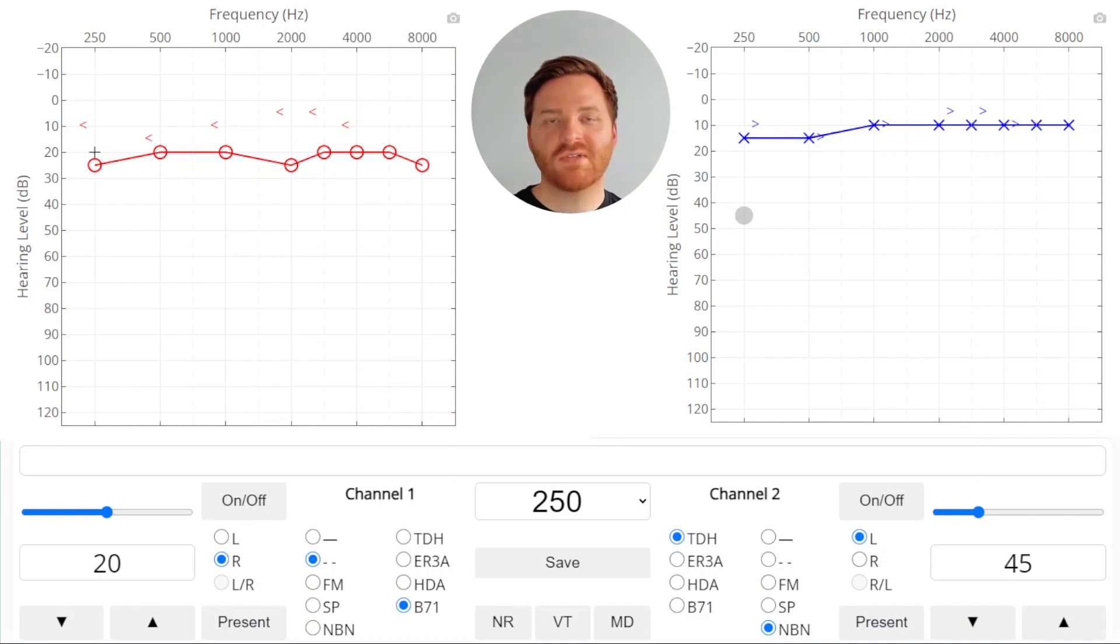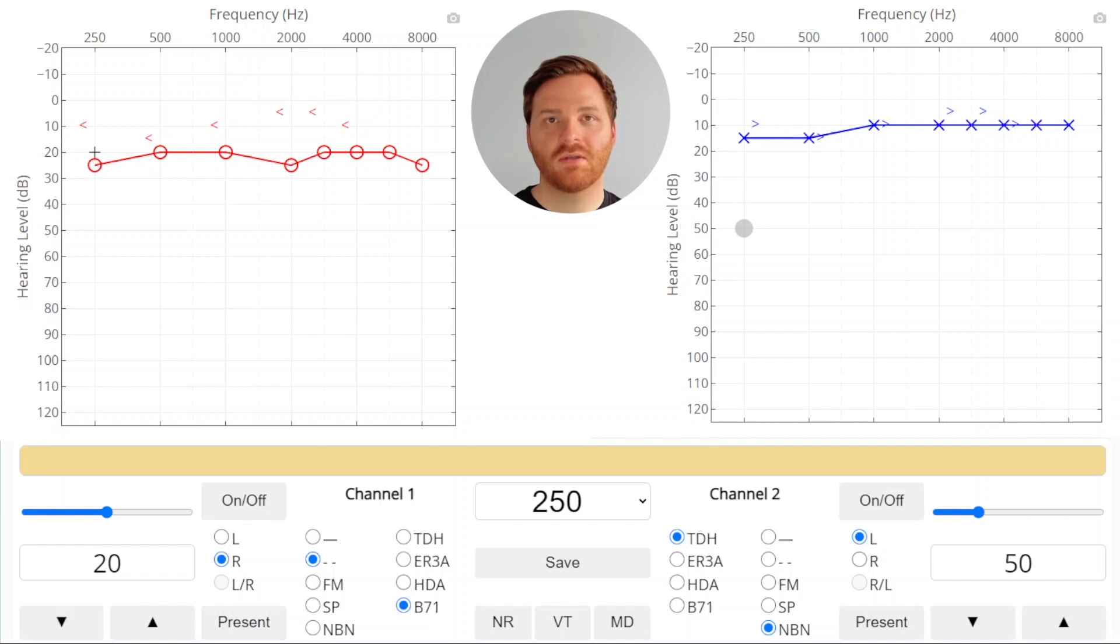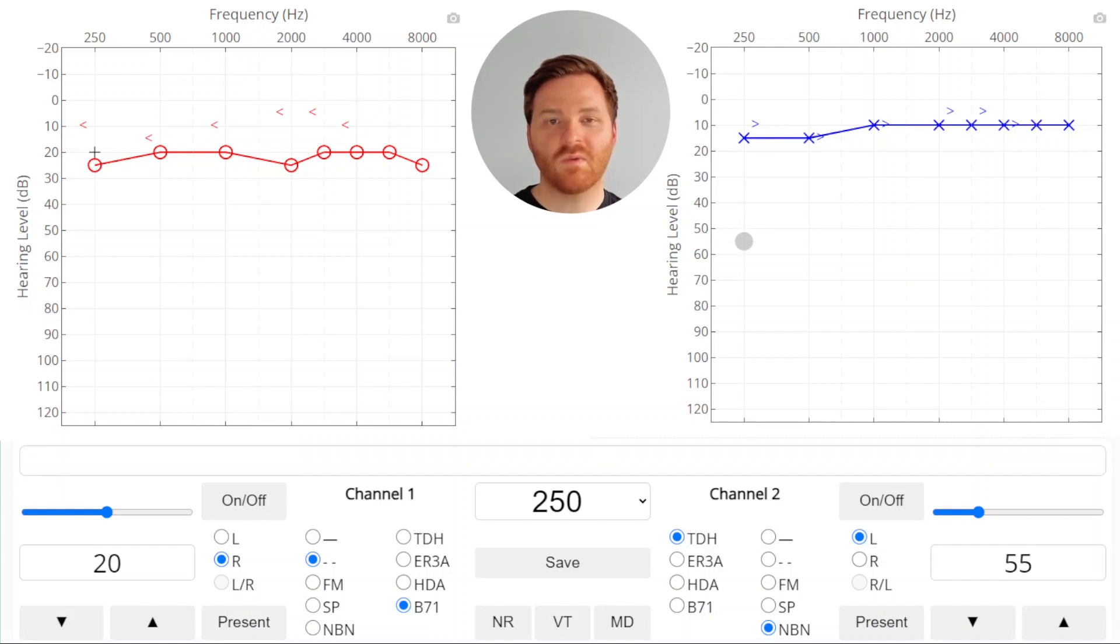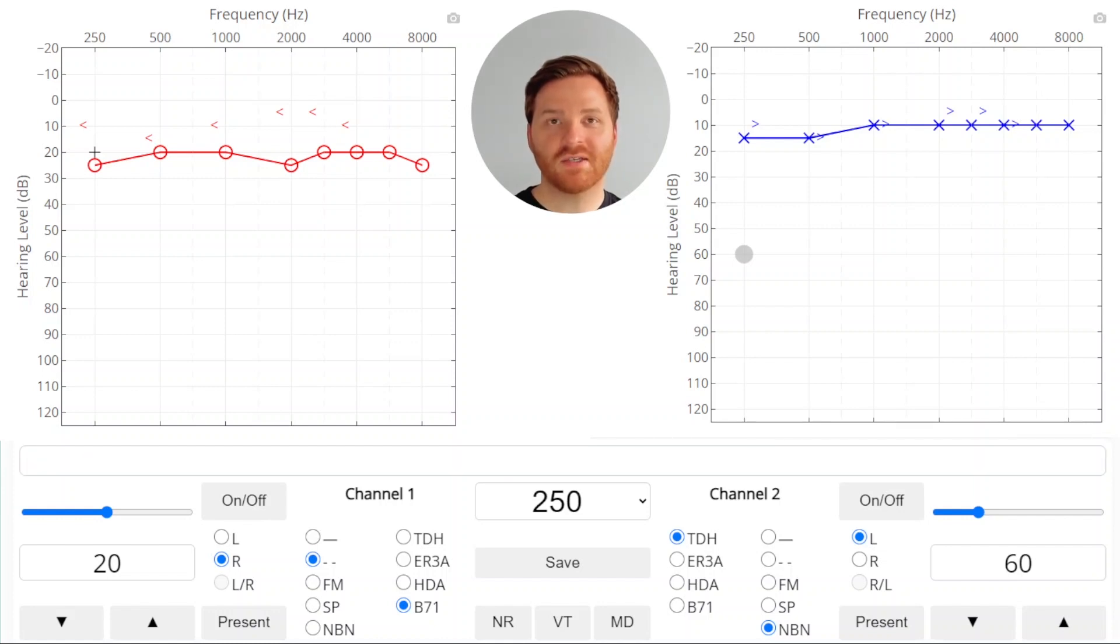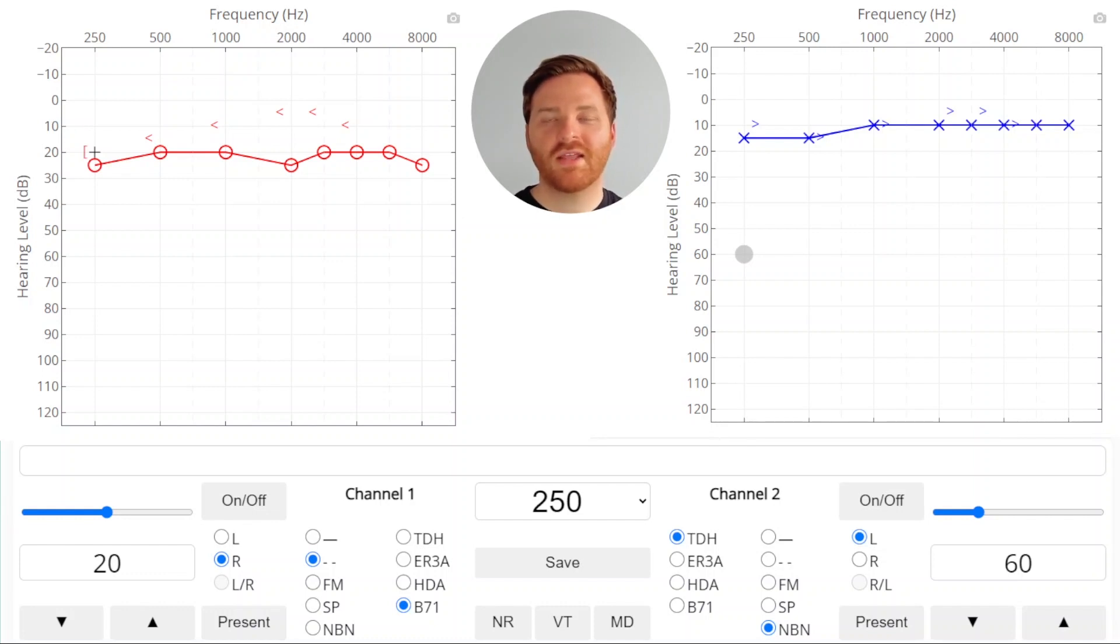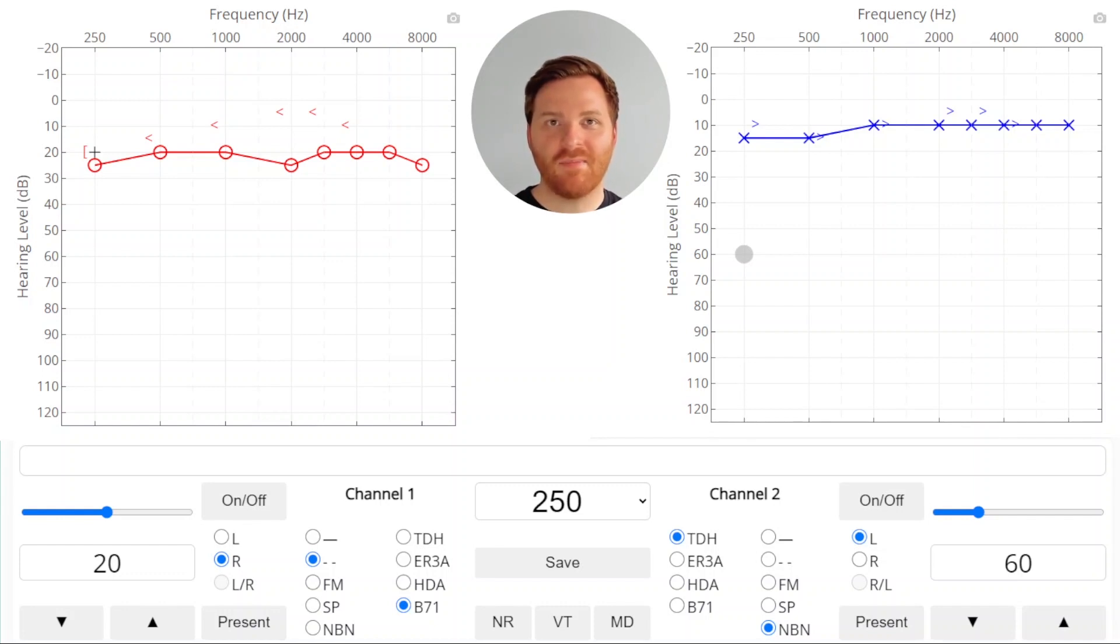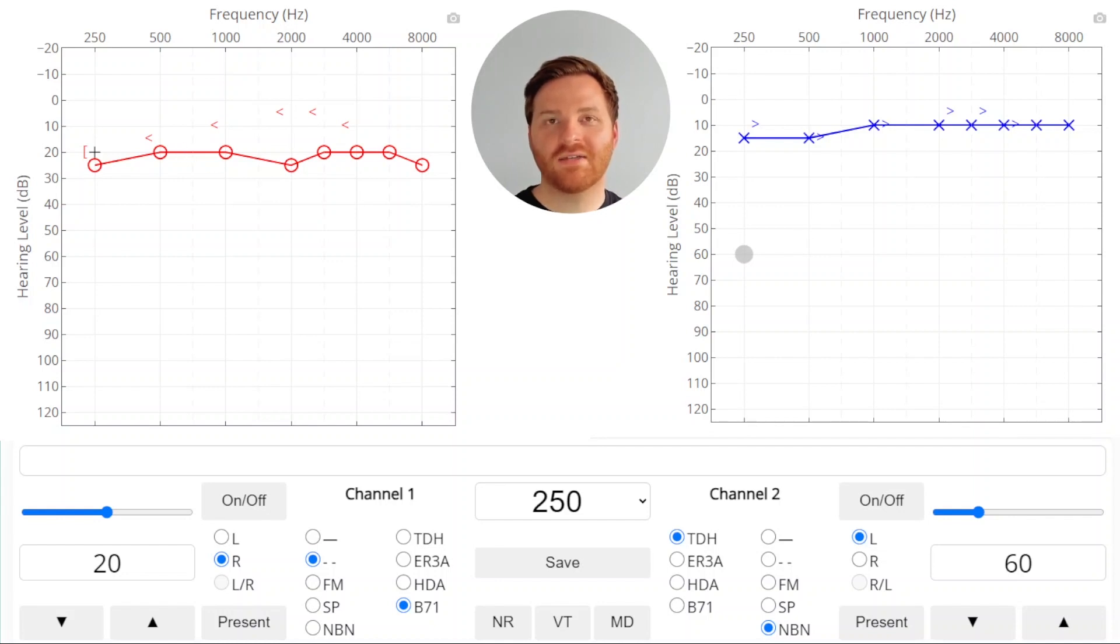So now we've presented the sound that's a little bit louder, and we're going to raise our masker. Every time the patient responds, we raise the masker. We got three consecutive responses with raising the masker, so we're going to save this as our true masked threshold. You'll notice that the air bone gap that we once had, a 15 dB gap, has now been reduced by 10 dB, and we would no longer say that we have a conductive component in the right ear.